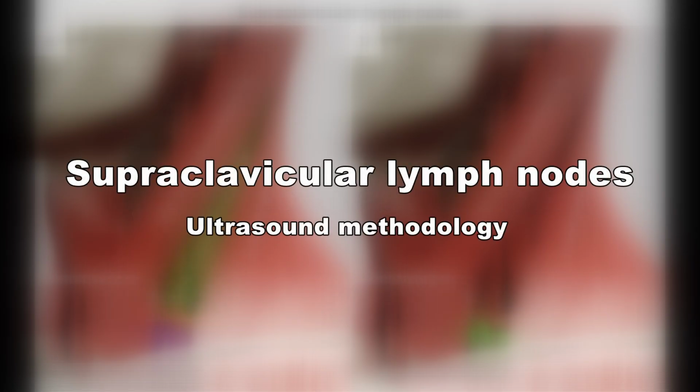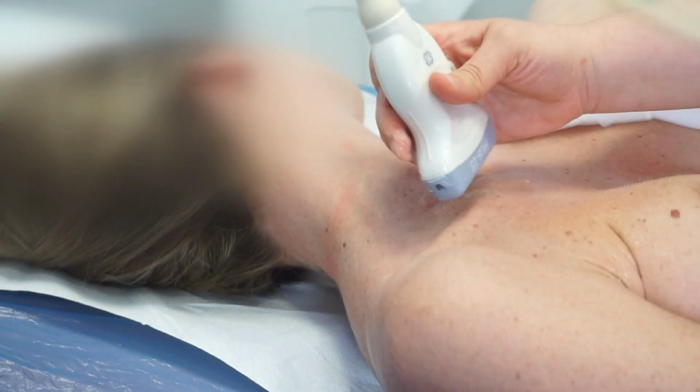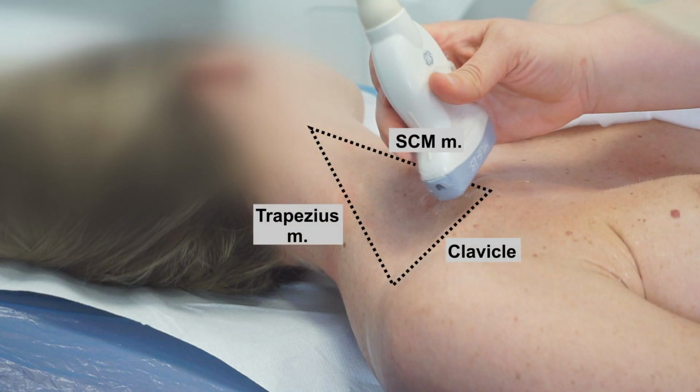In this video, the ultrasound assessment of the supraclavicular lymph nodes is shown. The patient lies in supine position, with the neck hyperextended and turned to the contralateral side. The region of interest is demarcated.